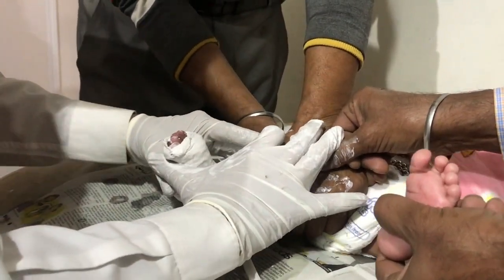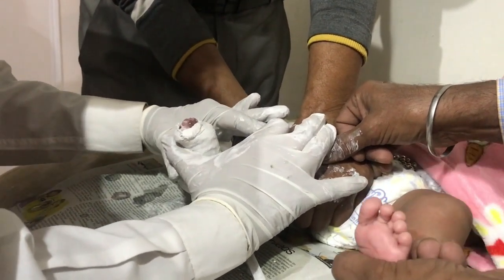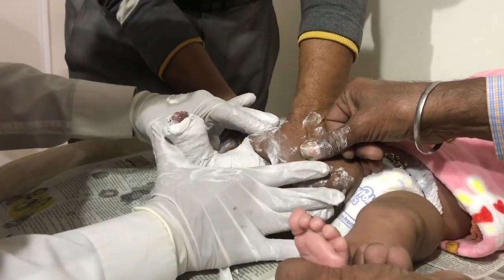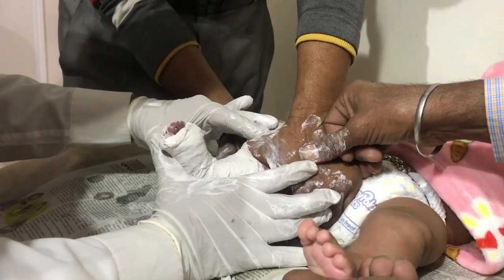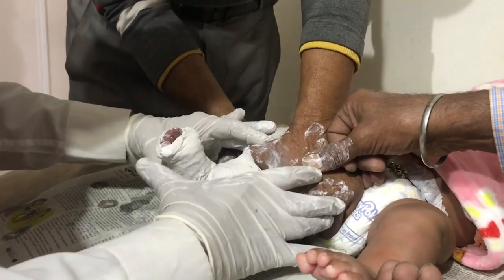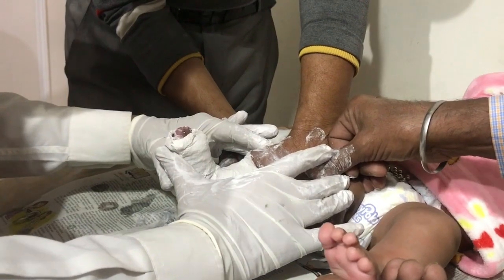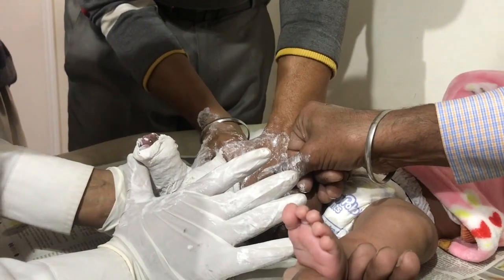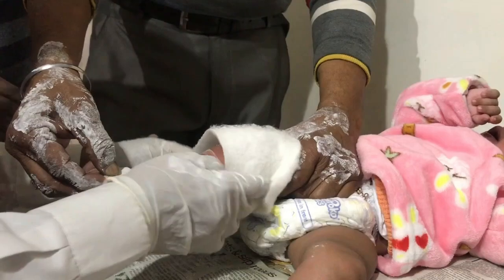The composite foot deformity is now corrected by the comprehensive maneuver acting at every joint from toes to the ankle, correcting all deformities and molding the cast around all contours. The equinus and talonavicular dislocations are corrected by pressing at appropriate places to bring down the heel, restoring the decreased talocalcaneal angle and index. When the cast is almost set, the assistant takes out his thumb from the proximal side for molding that part of the cast also.